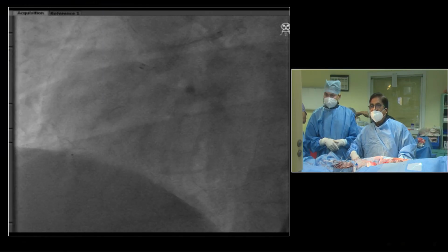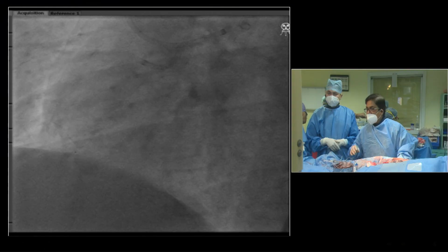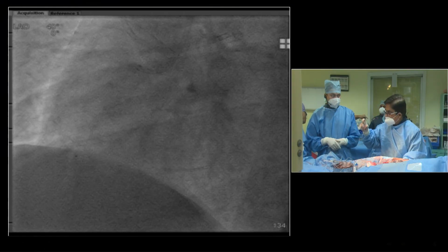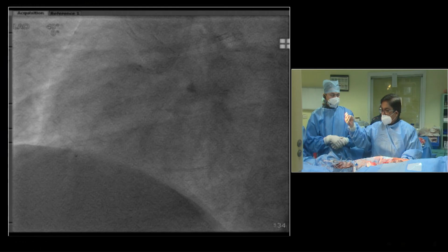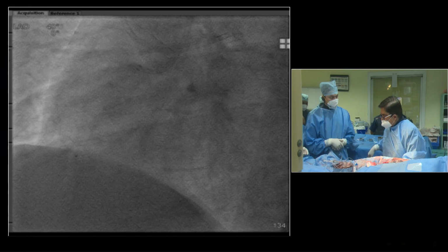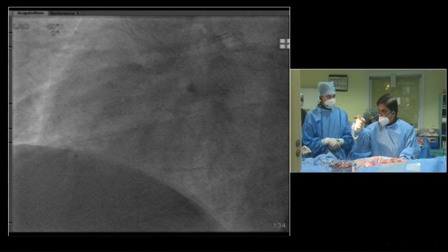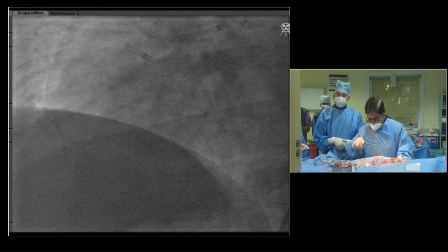Dr. Goel, did you have a problem taking the microcatheter down? It was easy? Well, initially it was not easy. You saw I got stuck about 10 millimeter below the occlusion. But then my wire moved forward and I went into the branch, and then it was successfully crossed. Once the wire is in, the second part, when I moved the microcatheter till the division, it was easy. But the initial part was very tough.